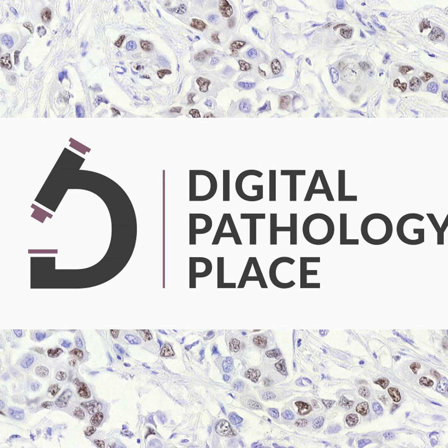Questions. Basically, because there's more science, because we understand more, we ask different questions. They cannot be answered with the previous methods, correct. That's correct. So there have to be new methodologies coming to the market. And in order for all of this to work, like David mentioned, multiplex immunofluorescence is highly complex. So having standardization, proper stainers, proper staining protocols, an imager which actually captures the image as it should, and downstream image analysis tools are all critical to ultimately answer these questions for the clinicians, the diagnosticians, or even researchers.